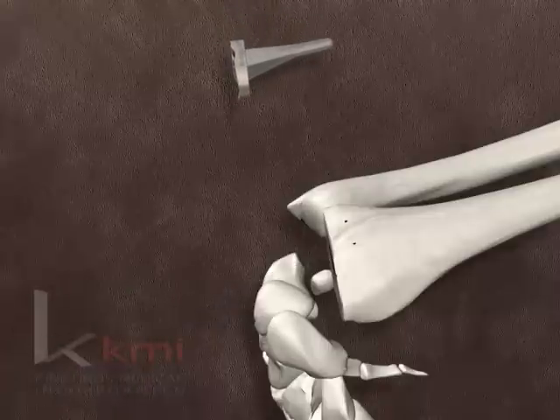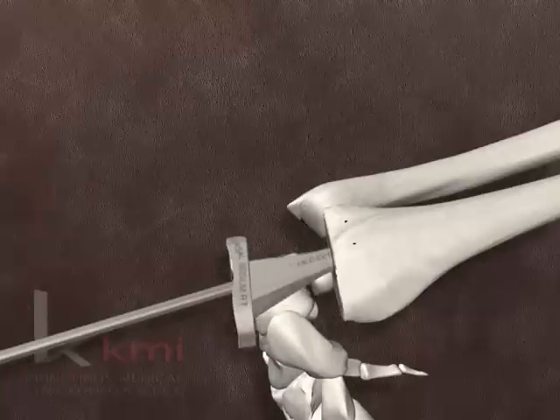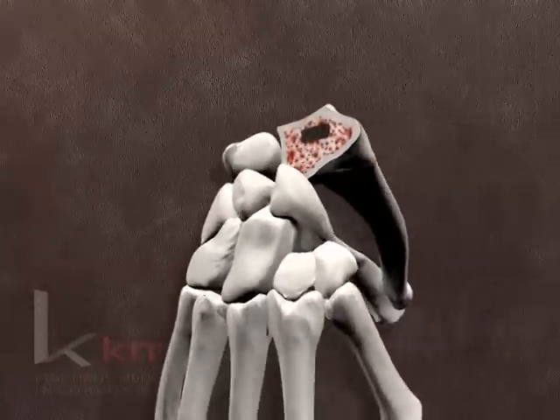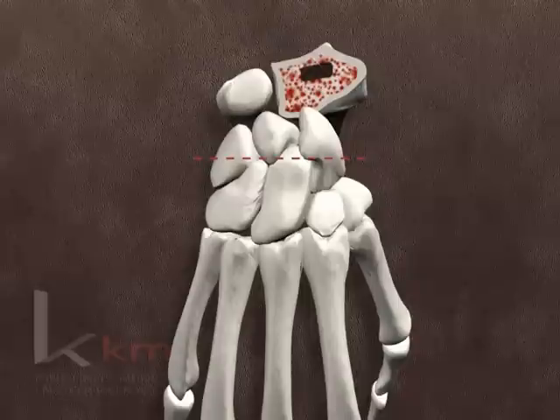A trial radial component is inserted using the impactor, with care to maintain proper alignment within the prepared metaphysis. The extractor tool is applied and the trial removed. The carpus is also resected in a minimal fashion, with the line of the osteotomy passing through the proximal aspect of the capitate, preserving substantial portions of the scaphoid and triquetrum.